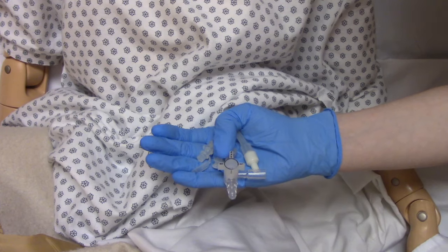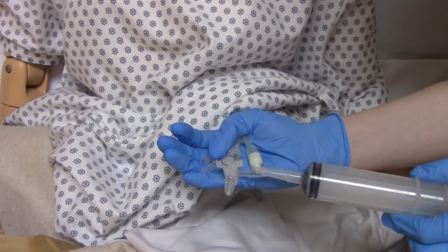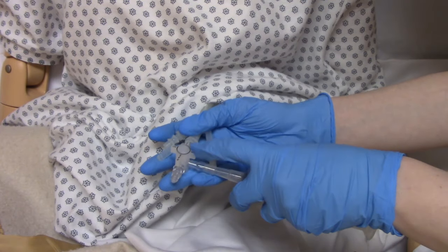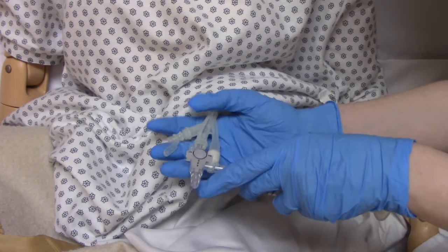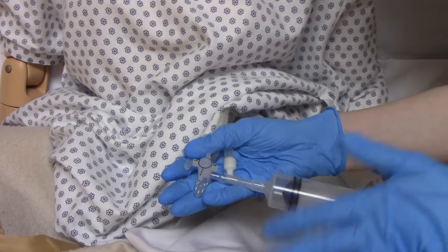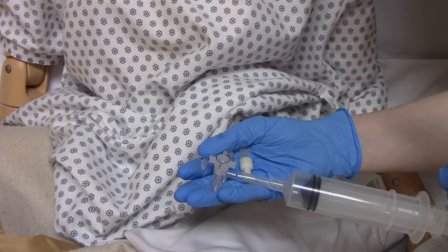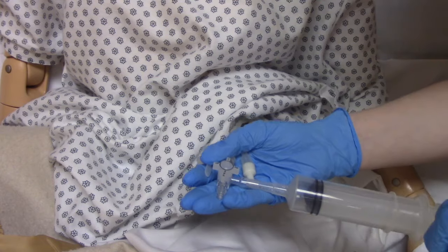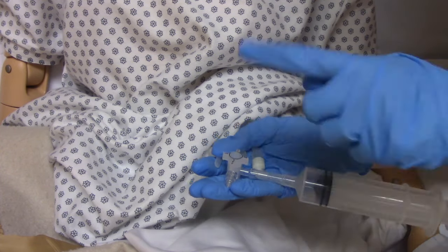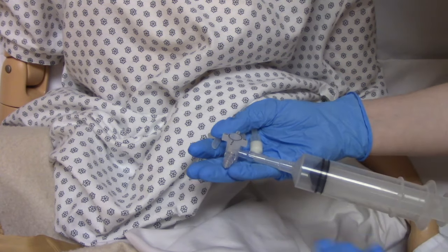Before giving any medication, we need to check for placement. Take your 60 cc syringe, attach it to the port, turn the valve so both arrows are open toward the syringe and the patient, and pull back for gastric contents. On a real patient, gastric contents would look greenish or brownish-yellow — it should never be red and never be black. If the patient had a tube feeding recently, you might pull back a little of that as well.